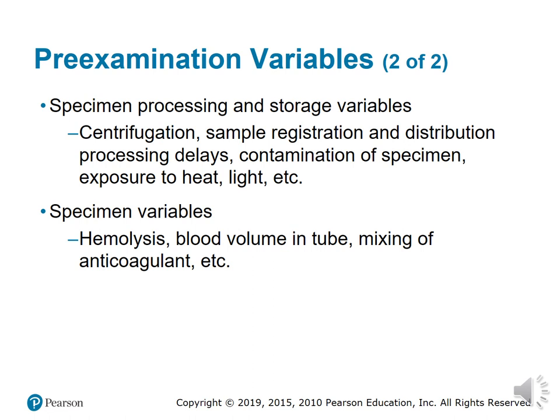Before we get it into the lab, another thing we have to be mindful of during transportation, and I forgot to add this, but now I'm adding it. During transportation, we have to make sure, depending on the test that we're drawing, that we transport it properly.